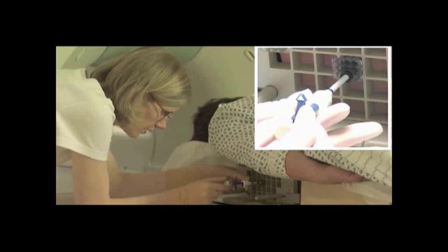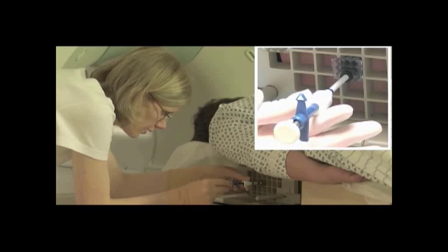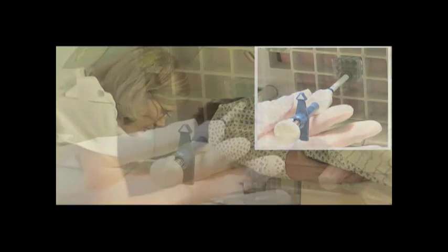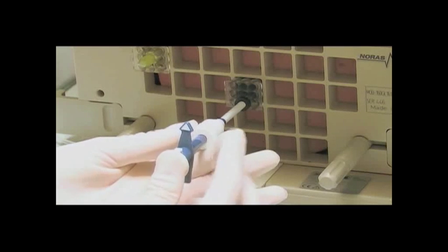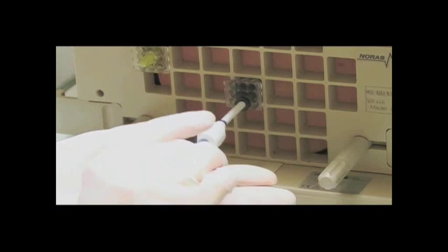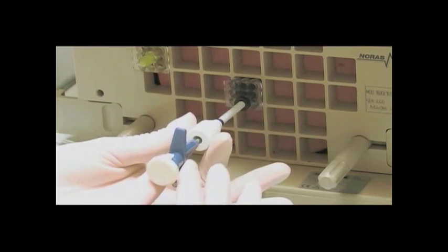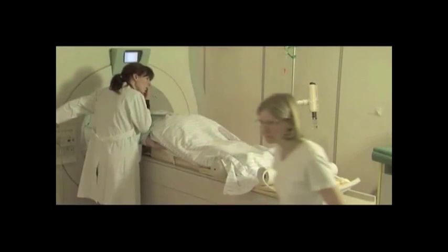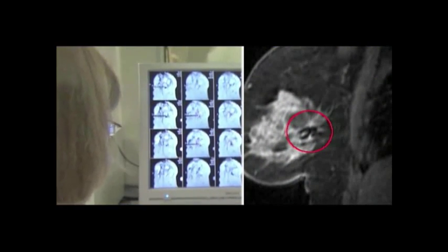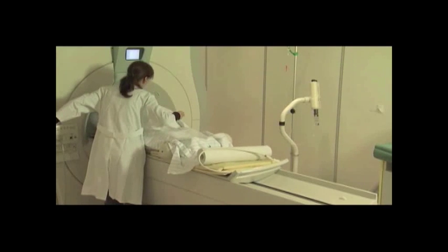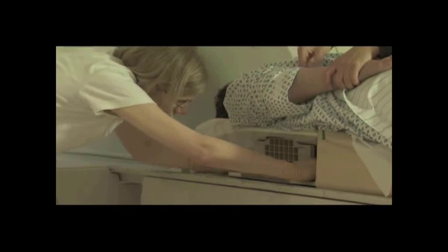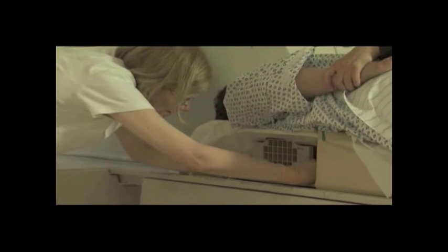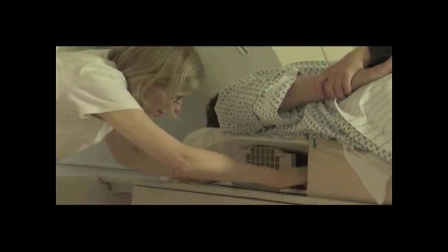To make sure this position is maintained throughout the deployment of the marker, hold the device in place with your free hand. Deploy the marker by pressing the plunger with your thumb. An audible and tactile click will confirm deployment. Slowly remove the deployment device from the introducer sheath. Shuttle the patient into the magnet for verification of marker placement. Once the marker placement has been verified, shuttle the patient back out of the magnet. Gently remove the introducer sheath from the breast and grid. Slowly decompress the breast and remove the compression grid.